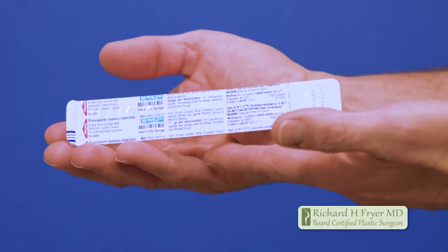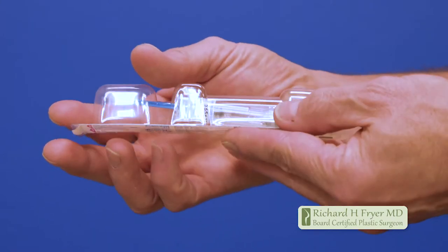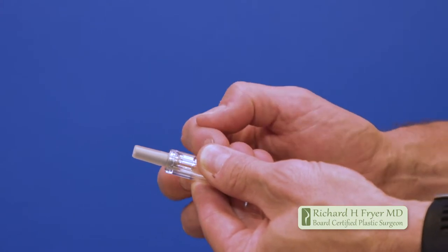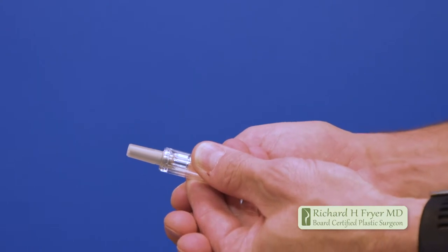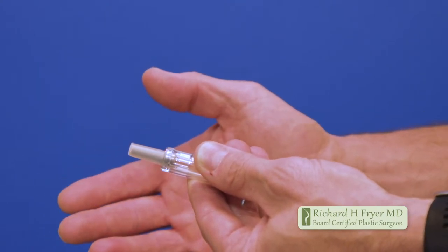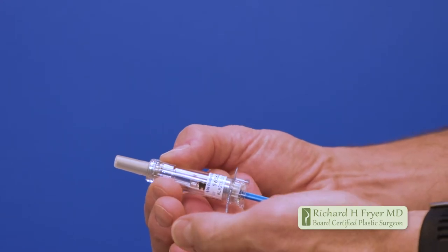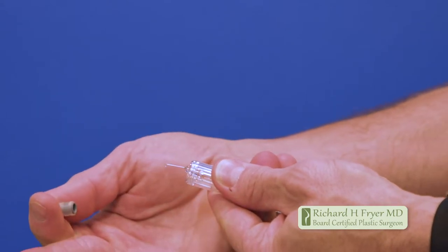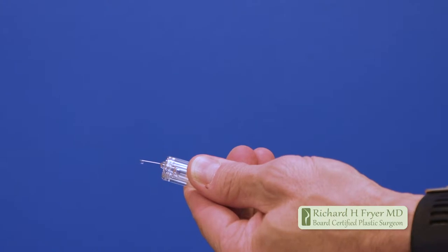First, familiarize yourself with the product. It comes in these pre-filled syringes — you don't have to draw it up. This is enoxaparin sodium, the generic for the blood thinner Lovenox. The injector is protected with a cap over the needle. The hard thing is getting this cap off — it's surprisingly tough to pull. You grip it firmly and pull just like that to expose the needle.